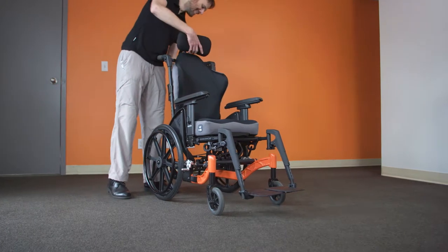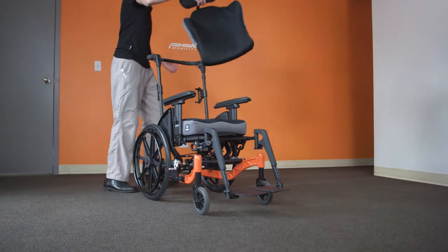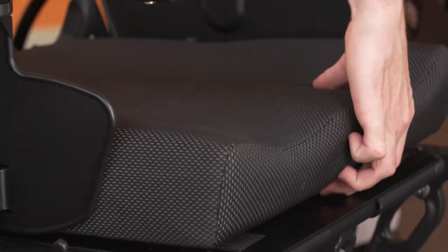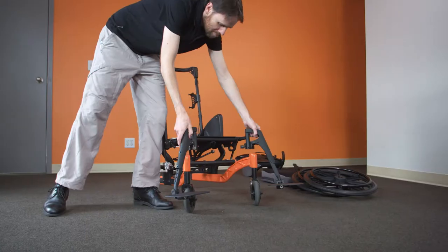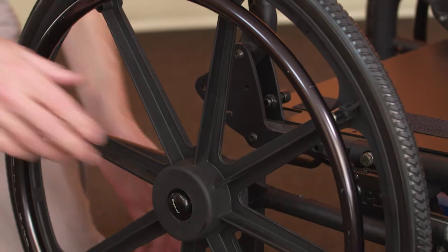Remove all quick-release accessories from the chair, including the backrest, cushion, armrest, front rigging, and wheels.